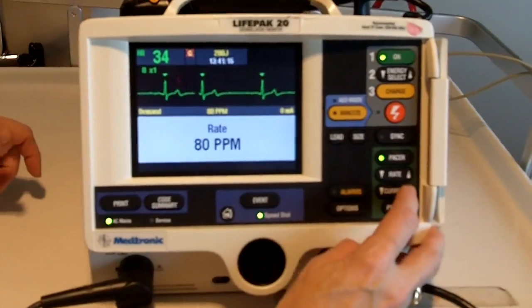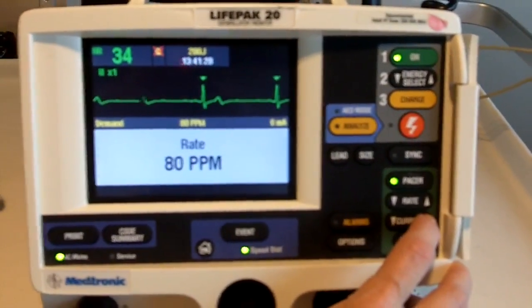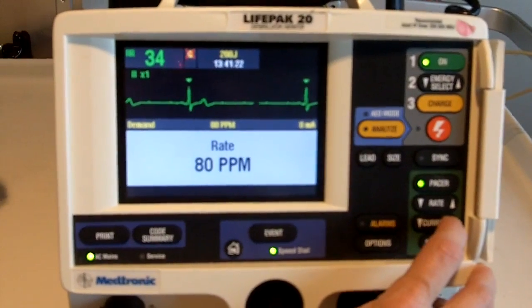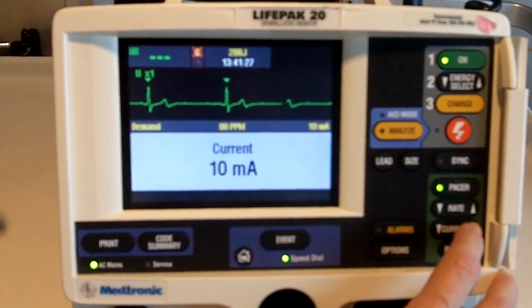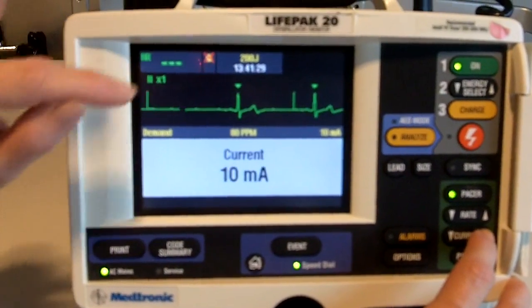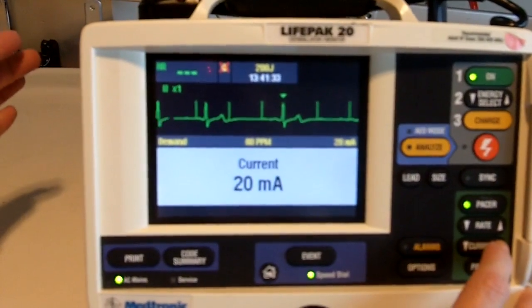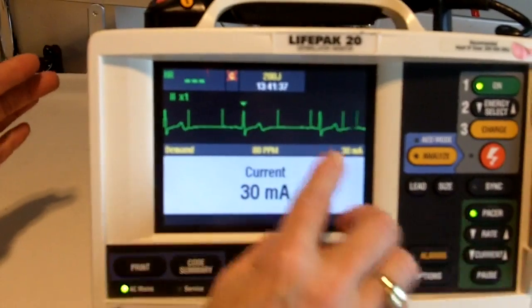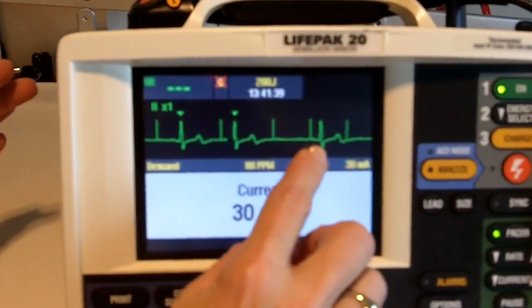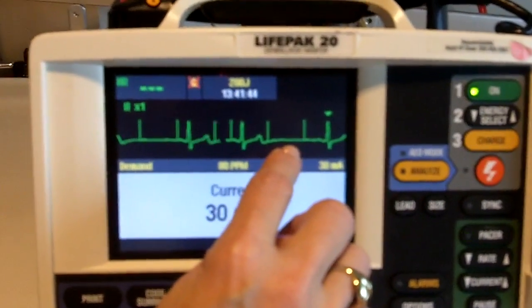I then want to dial in how much electricity I want to deliver to the chest wall in order to provide a contraction to the heart. This is measured in milliamps. I'm going to dial up until I see a spike followed by a QRS complex, starting low and continuing to go up until I see capture. Here I have it — a spike followed by a QRS complex, which means my patient responded to the pulsing energy.